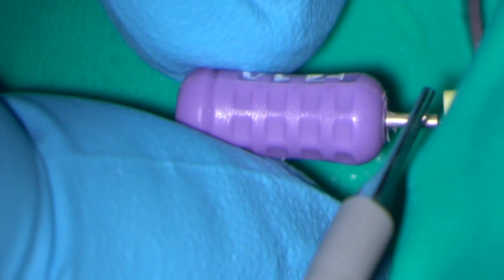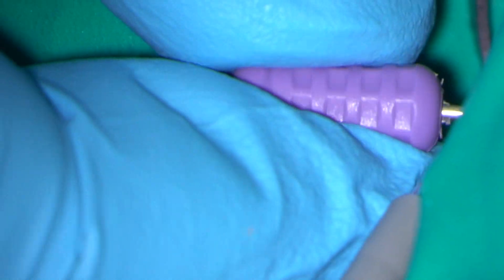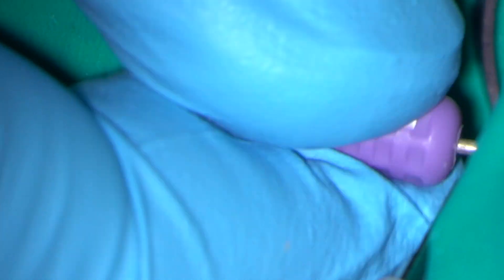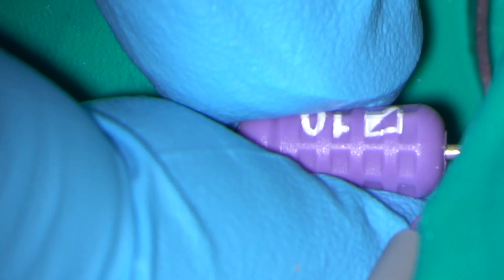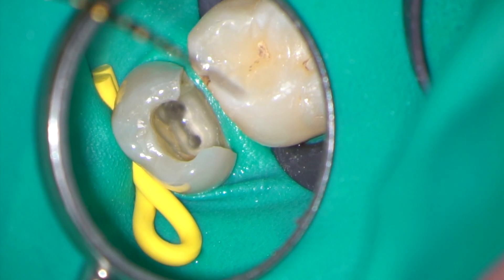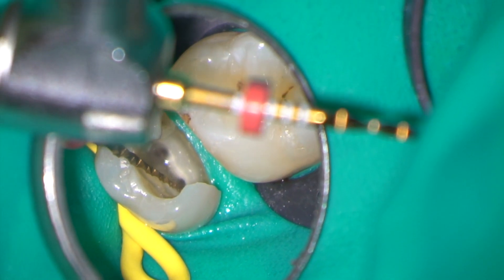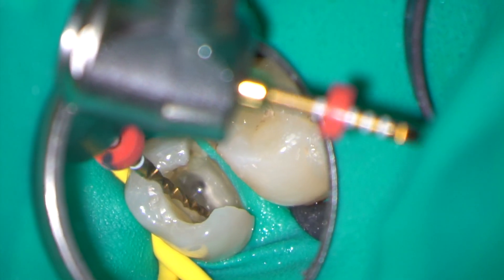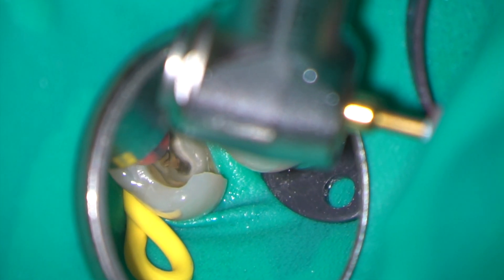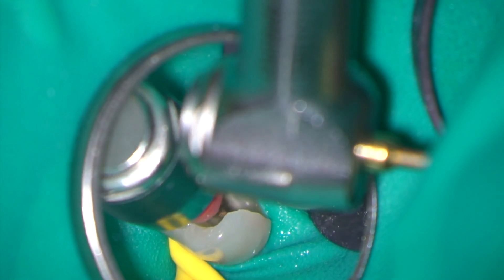I am now using an electronic apex locator to assess the working length in the palatal and mesiobuccal canals. After establishing a glide path with a size 10 hand file, I then used a primary Wave 1 Gold instrument to taper the palatal and mesiobuccal canals.